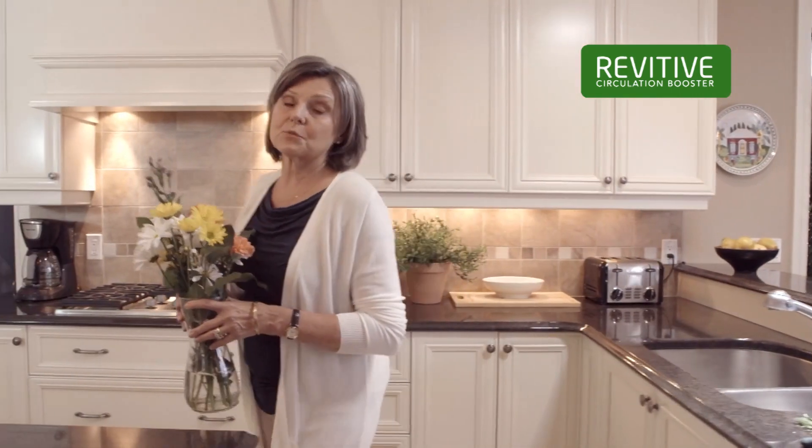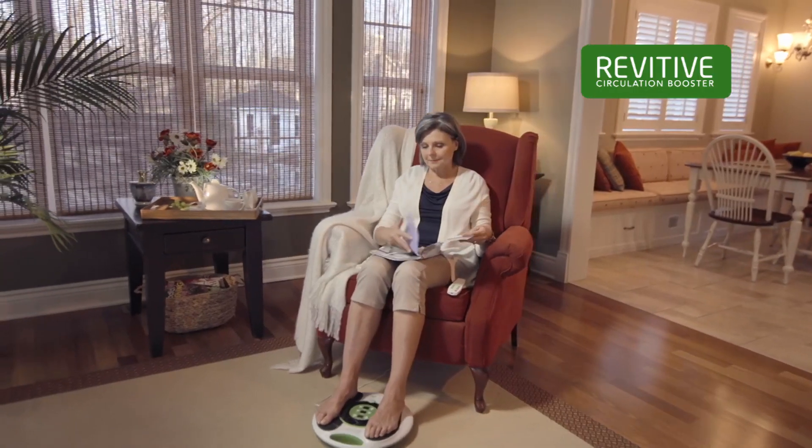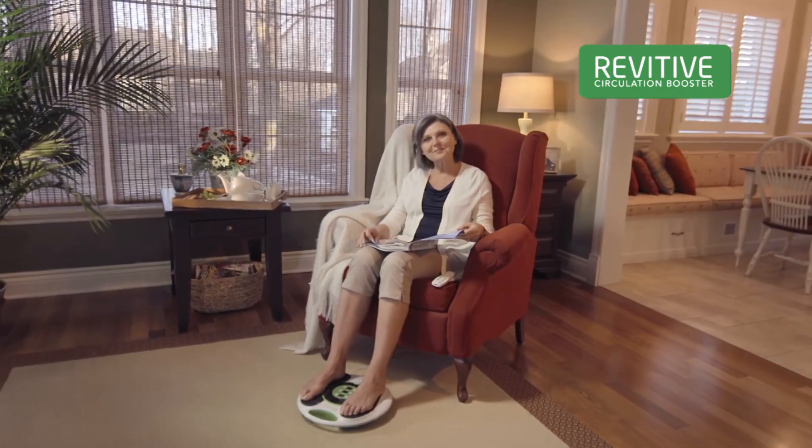I used to get aching legs and swollen feet. But then my pharmacy recommended Revitiv Circulation Booster. And without pain, I get around much better.